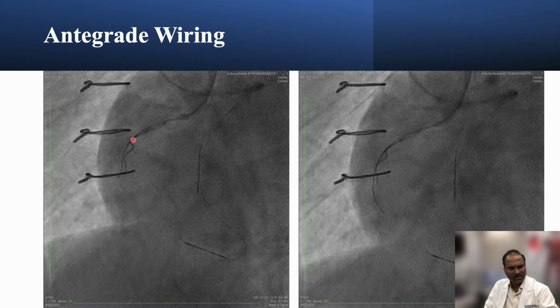And then we took antegrade wire escalation. And one thing which is important is we took a distal septal this time, so as to go through the PDA, which gives us good support, rather than the last septal which was entering at the crux.